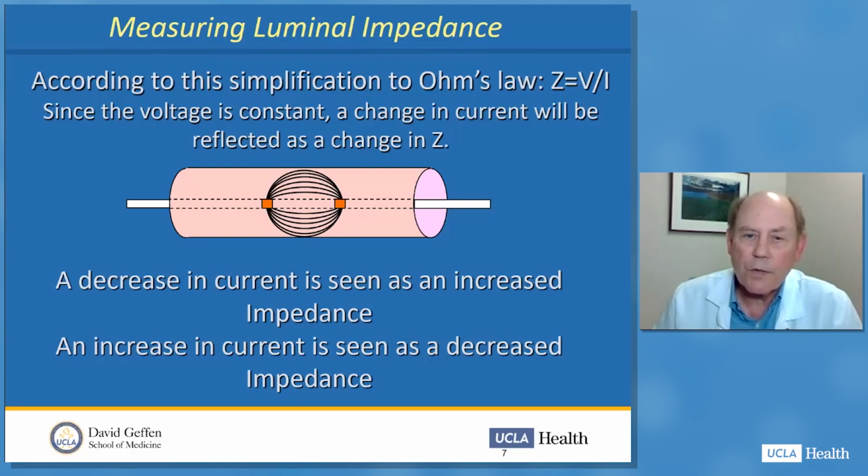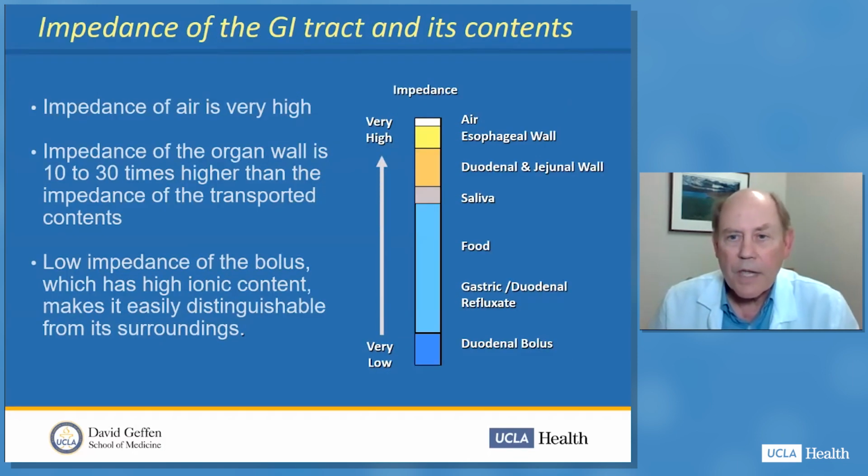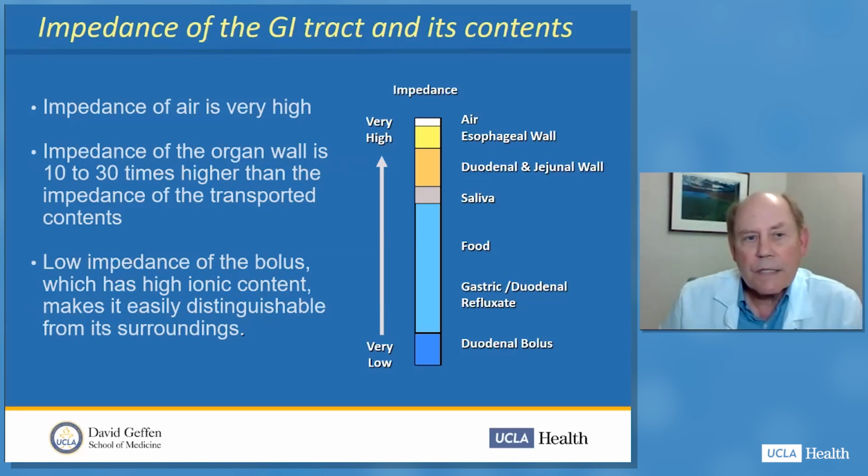According to this simplification of Ohm's law, since the voltage is constant, a change in current, which we record, will be reflected as a change in impedance. So a decrease in recorded current is seen as an increase in impedance, and an increase in current is seen as a decrease in impedance. Now we have to remember that we can see the bolus in the esophagus because the impedance in a bolus that's either swallowed or refluxed is usually quite a bit lower impedance than the wall of the esophagus.